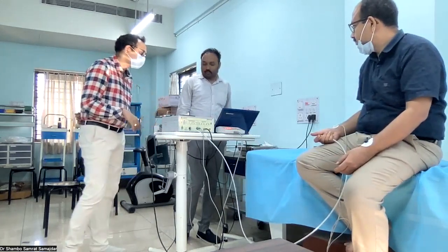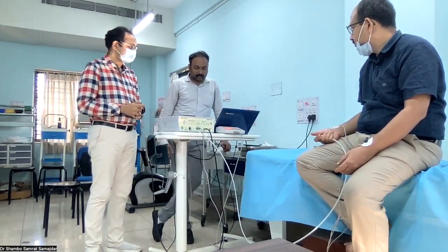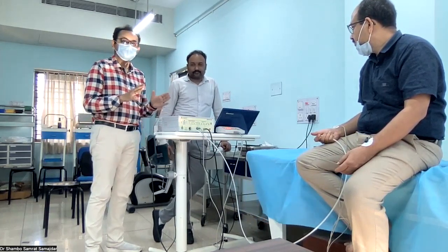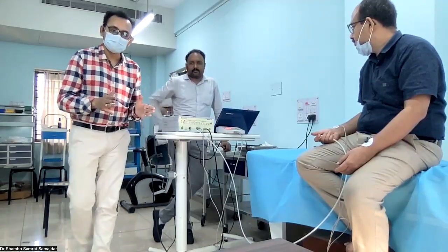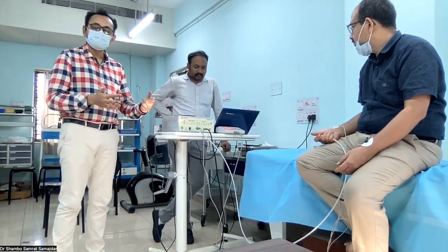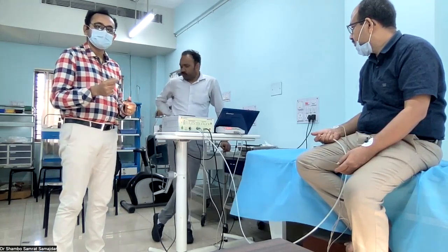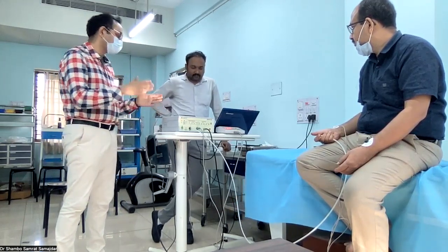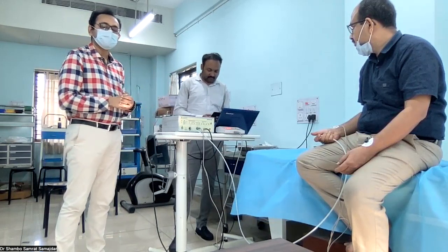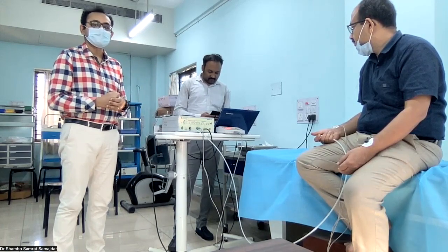So now we will move on to the sympathetic part, which has the postural hypotension checking part, and after that we will go to the sustained handgrip test. So already we had completed the parasympathetic nervous system panel, Valsalva ratio, and the inspiratory expiratory ratio. Now we have to move to the sympathetic nervous system part, and to check it, we should mention whether orthostatic hypotension is there or not, and also we need to check the isometric hand grip test exercise, diastolic blood pressure change report. So let's see.